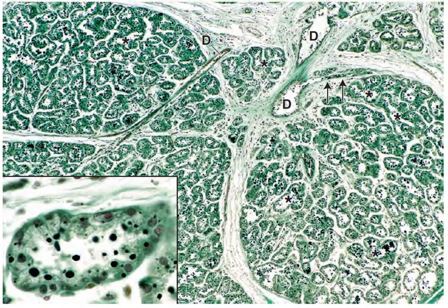It is similar in appearance to the gland at the late proliferative stages, but differs mainly to the extent that the alveoli are more uniform in appearance and their lumina are larger. As in the late proliferative stage, several alveoli can be seen merging into one another. Right here, where there's an asterisk, you can kind of see that, right? The use of osmium in the specimen stains the lipid components of the secretion, so the inset reveals the lipid droplets within the epithelial cell cytoplasm, as well as lipid that has been secreted into the lumen of the alveolus.